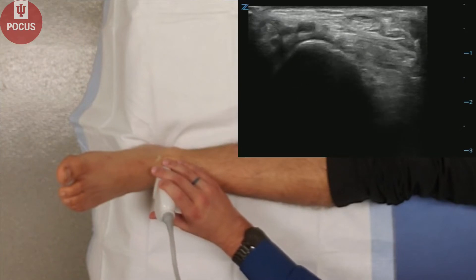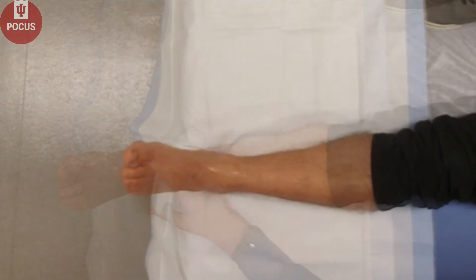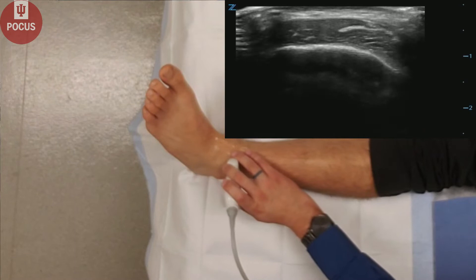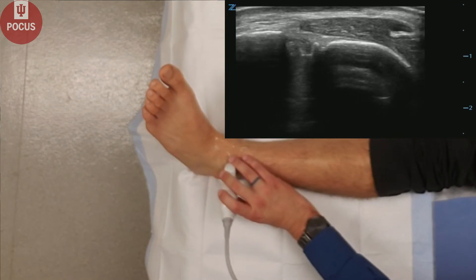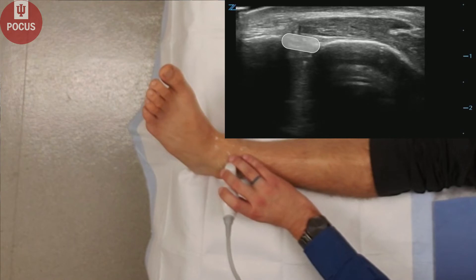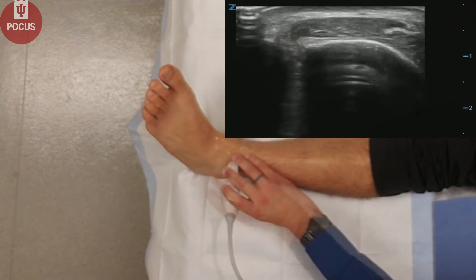You can use the ultrasound to find it in the anterior ankle. Next, we'll have our patient invert the ankle, and we'll look at the anterior inferior tibiofibular ligament, which is right here. It's a common site of high ankle sprain.